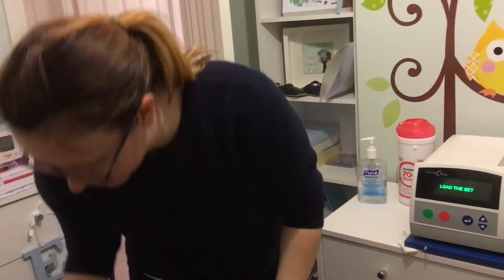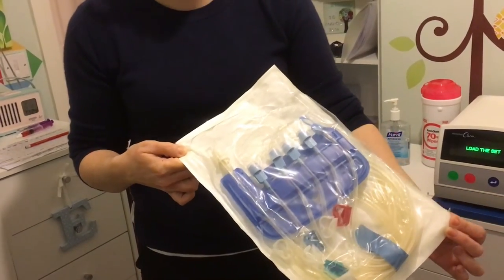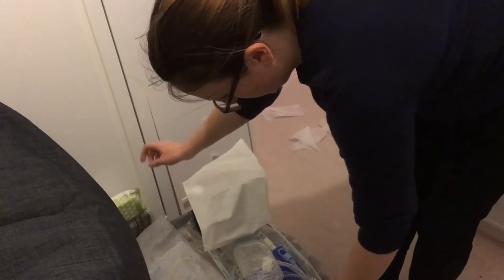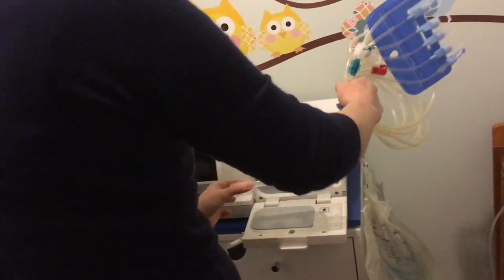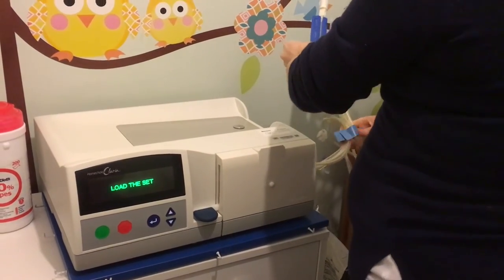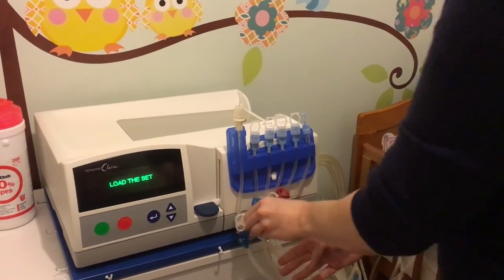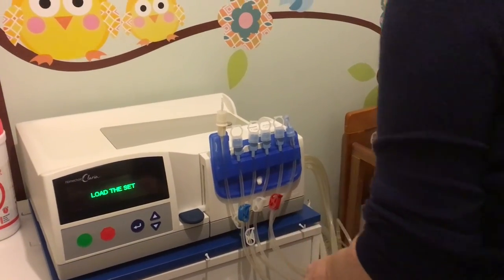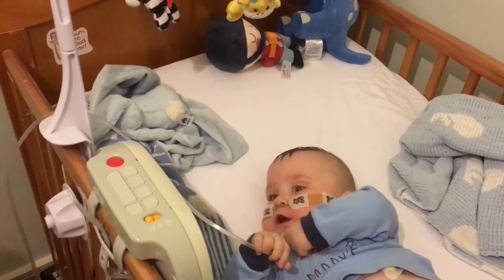Then it asks me to load the set. This is the cassette — it has lots of wires coming from it and carries the fluid all around the machine. I insert it into the machine, open up the slot, being very careful not to touch it to avoid damage. It slots in, I close the door, and the little blue piece sits on the front. Next I close all the clamps — they're different colours so you know what they attach to. That's clamps four, five, and six at the bottom.